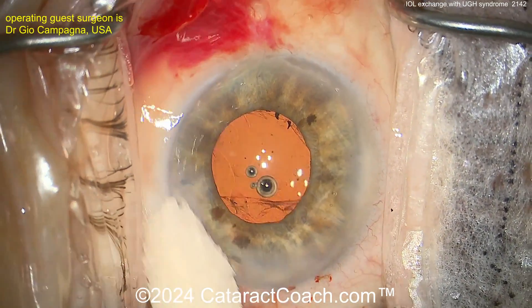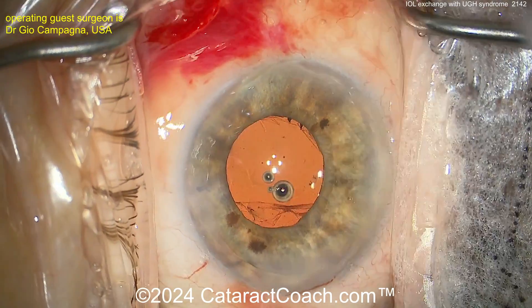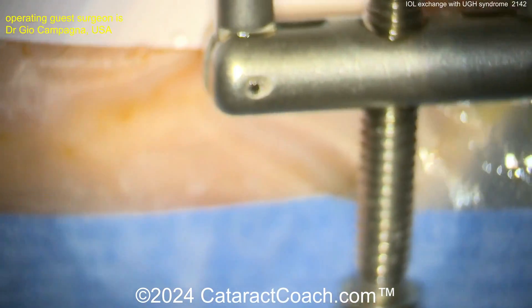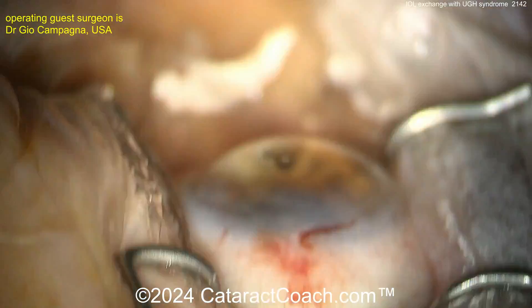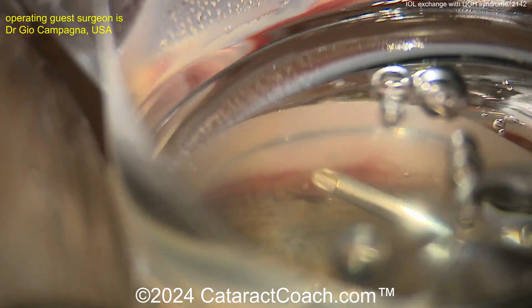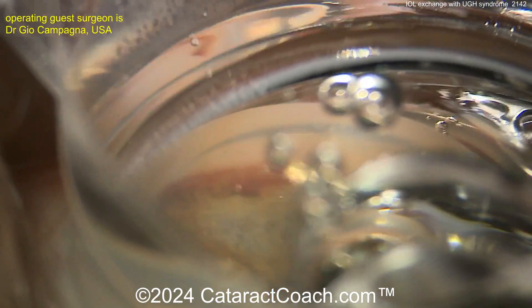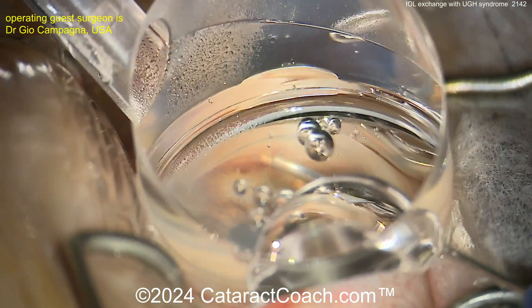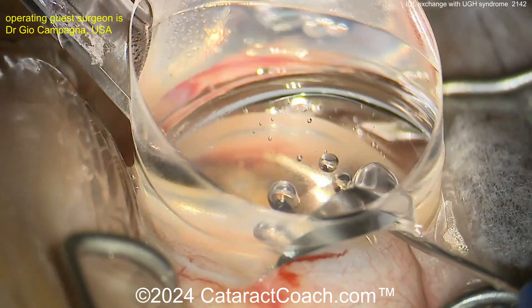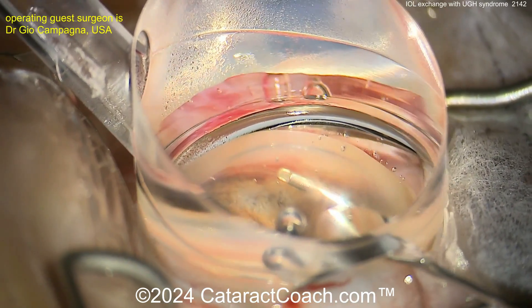This patient also needs some treatment for chronic glaucoma issues. So let's see what we're going to do — tilting the head out of the way, probably going to use a gonioscopy prism. There is the prism, and looks like a canaloplasty device — maybe the iTrack going in there. Viscocanaloplasty — that's going to help the patient. Put the prism back down, and this patient is going to have a nice outcome.